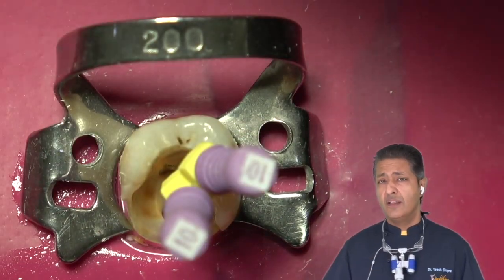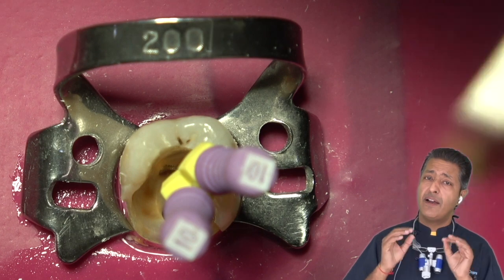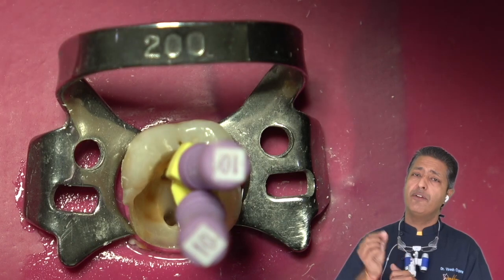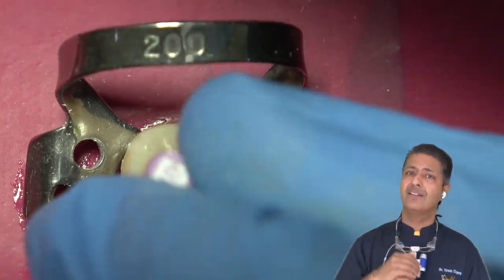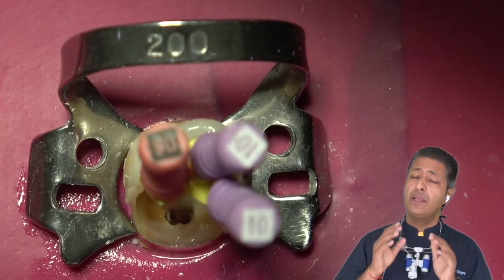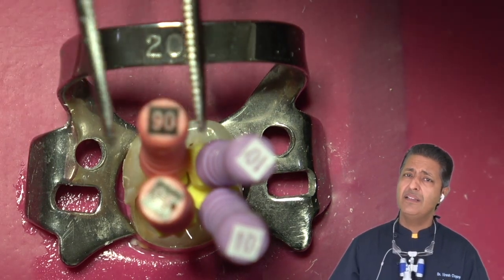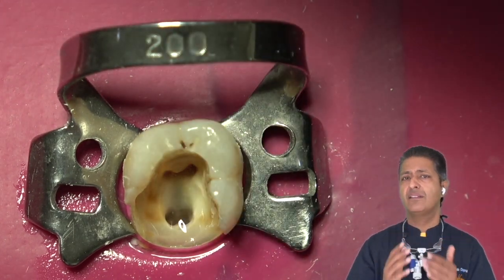Often I have heard that we all face difficulty while negotiating the mesial canals, or while placing the files inside the mesial canals of mandibular molars. We can use a locking tweezer to hold the file. We can pre-curve the file, and while inserting we can take care that the pre-curved part of the file faces towards the mesial side, so that we don't have to angulate our hand inside the throat of the patient. By following these steps, we can, without using any force, place the file in the mesial canals, and once the file is placed inside the mesial canals, we can just adjust our visibility for the distal canals and place the files inside them.